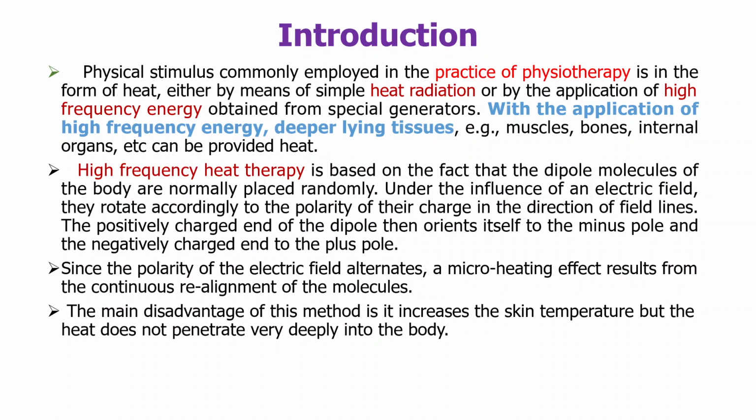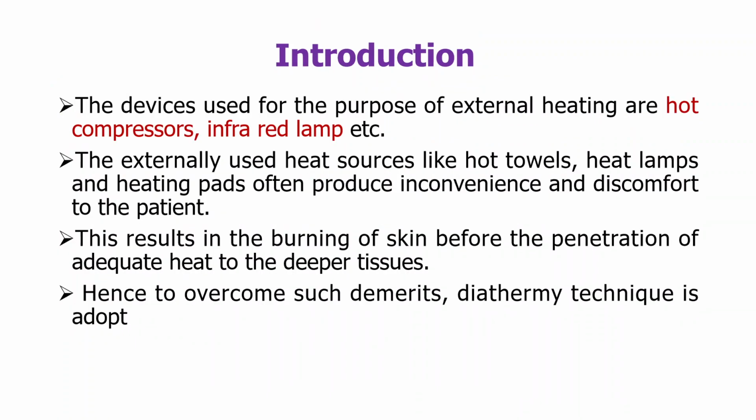So an electric field is applied. Because of the electric field, a micro heating effect results in our molecules. The disadvantage is that sometimes it increases the temperature. Skin temperature will be increased, but here the heat is not penetrated properly into the body.